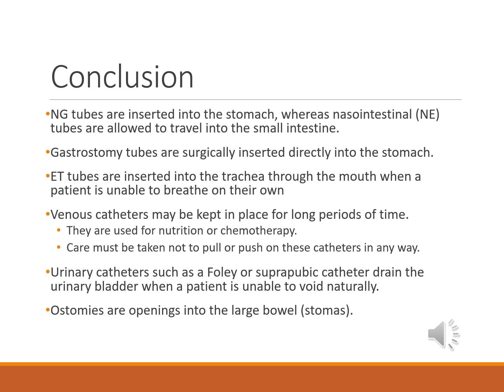Tissue drains may be used in patients post-surgery to remove fluid and blood from the area. It's important to never allow tension to be placed on the drain because it might cause dislodgement. Urinary catheters such as Foley, suprapubic, or the external catheters should never be removed, and it's important when transporting a patient with a urinary collection system never to raise the bag higher than the level of the bladder. This can cause flow of urine back into the bladder, which can leave patients susceptible to infection.